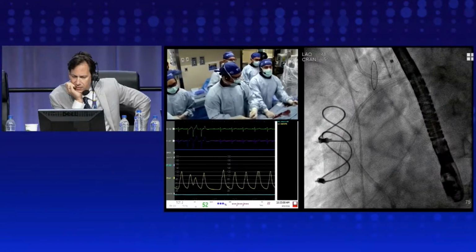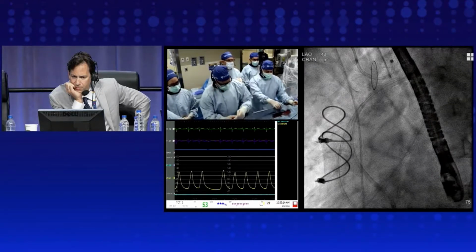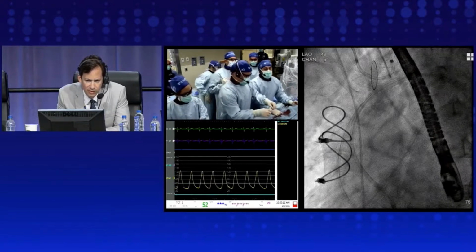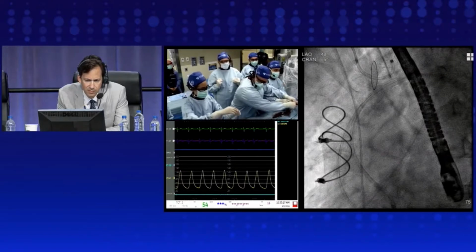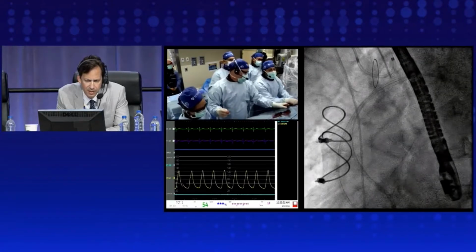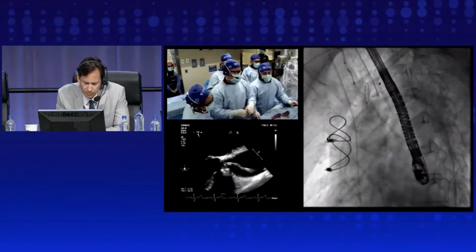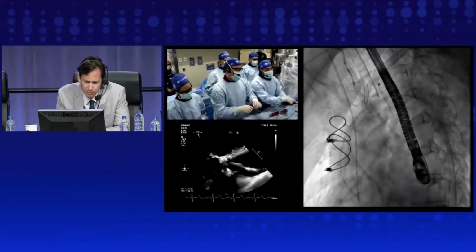I think one thing on this one, Vasilis, is that she'll tolerate it well because it's been very, very chronic. So we don't anticipate that much hemodynamic compromise, but obviously we're always watching carefully. She interestingly had the equalization of the diastolic pressures at the end of diastole between the LV and the aorta. In about 10% of cases, maybe 15, we see true hemodynamic compromise. Sometimes we need to rush, but rarely it happens.